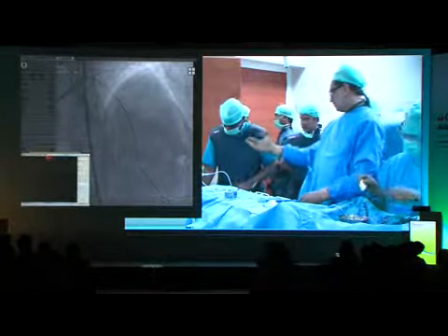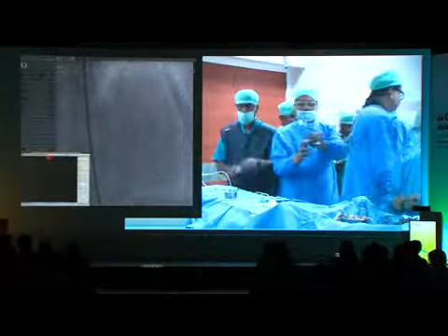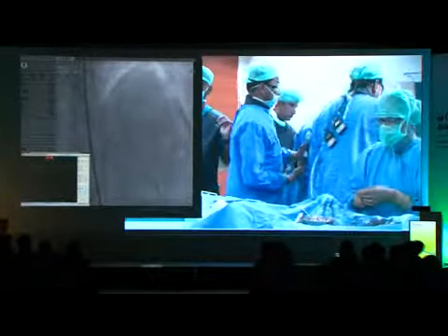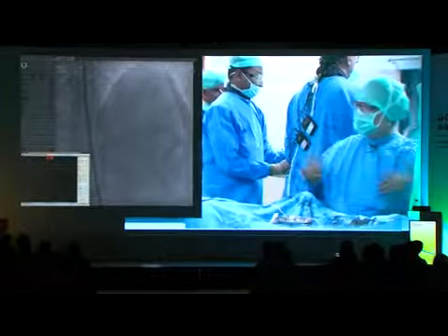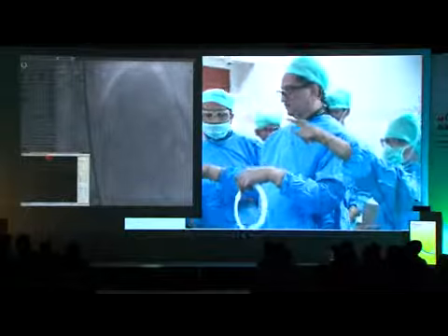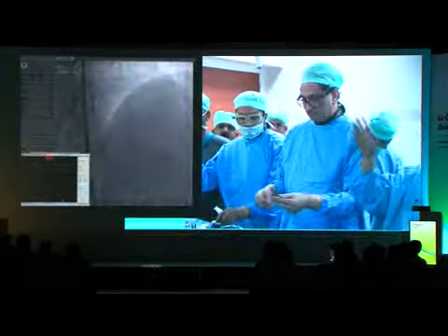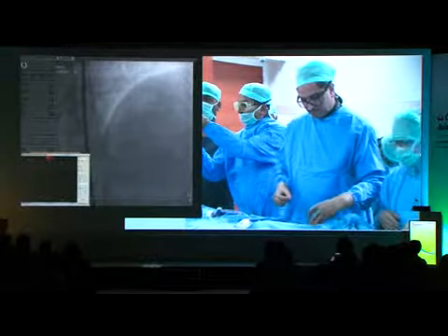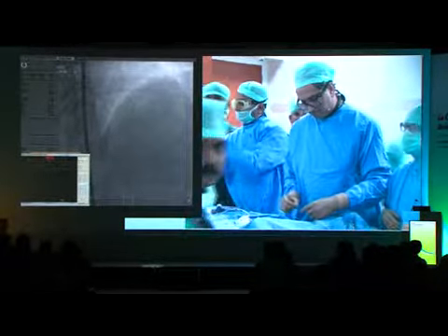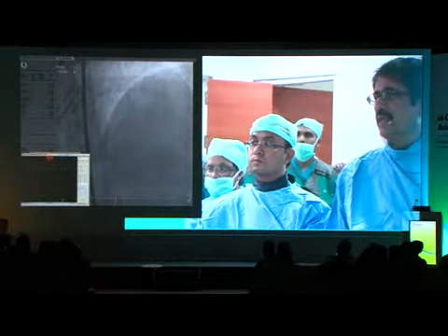After that, it's just a matter of routine. So you can switch, and we will show you what we did after. You see that there is a big diagonal up there, so we'll have to protect it. On that injection, we see that there is a big diagonal.